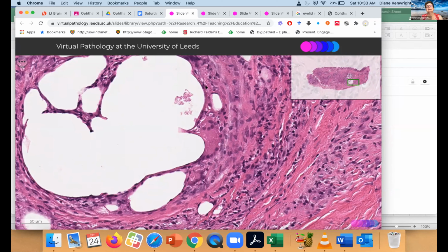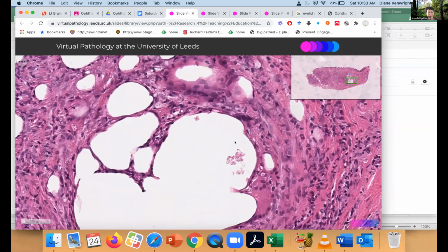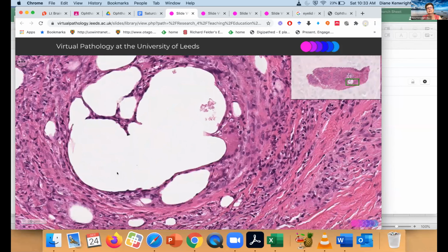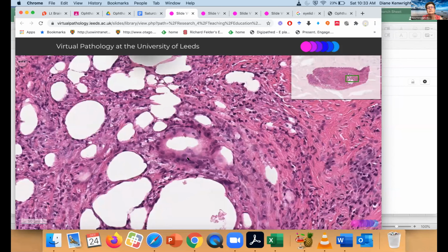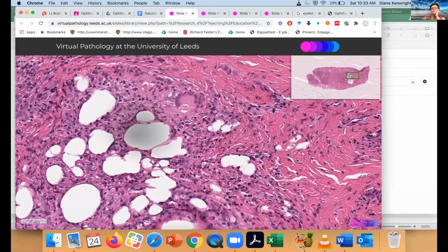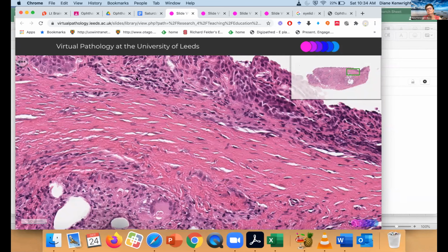Aren't they pleomorphic looking? How do we know it's not a sebaceous carcinoma? Good question. Sebaceous carcinomas originate from sebaceous glands, and there aren't any about. Oh, there's another lovely giant cell here. But they're often associated with the epidermis. The sebaceous glands have cells in them that, if we're lucky, have really finely divided fat in them, rather than the giant globs of fat here.